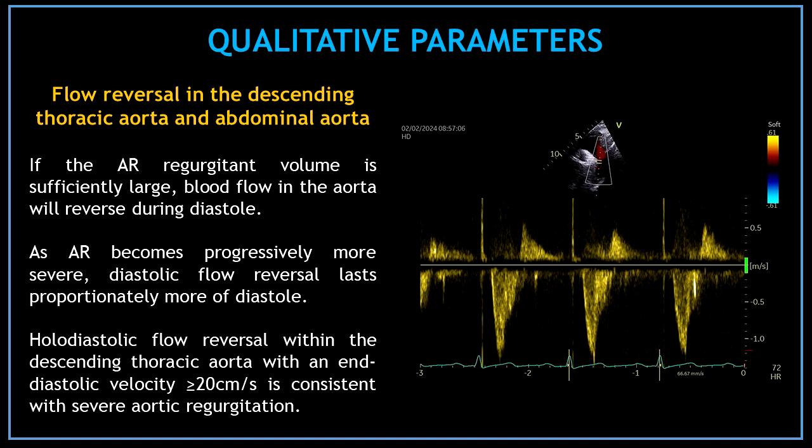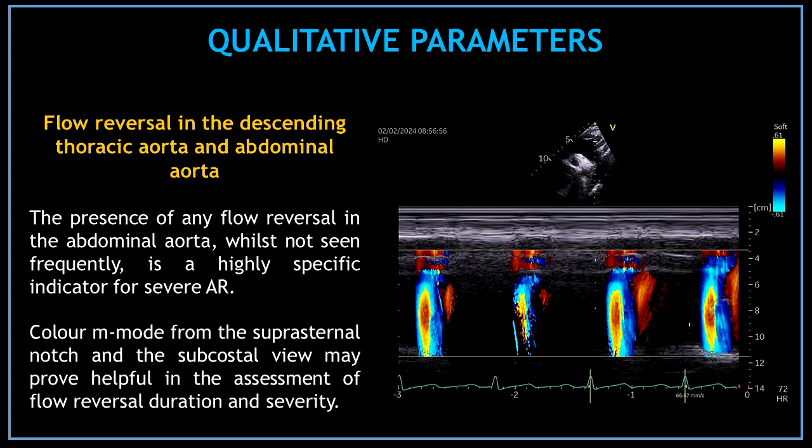The next qualitative parameter for the assessment of aortic regurgitation is the flow reversal in the descending thoracic aorta and abdominal aorta. If the aortic regurgitation regurgitant volume is sufficiently large, blood flow in the aorta will reverse during diastole. As aortic regurgitation becomes progressively more severe, diastolic flow reversal lasts proportionally more of diastole. Holodiastolic flow reversal within the descending thoracic aorta with an end diastolic velocity greater than or equal to 20 cm/s is consistent with severe aortic regurgitation. The presence of any flow reversal in the abdominal aorta, whilst not seen frequently, is a highly specific indicator for severe aortic regurgitation.